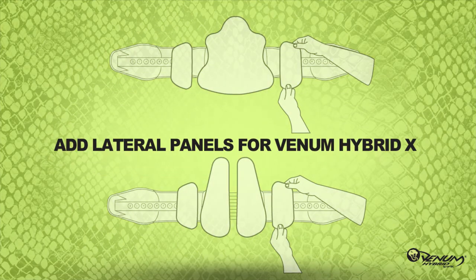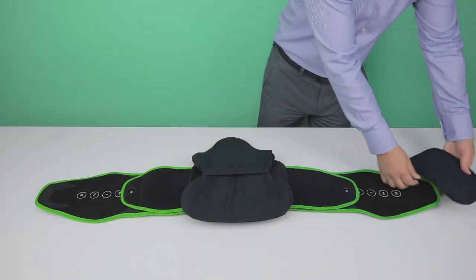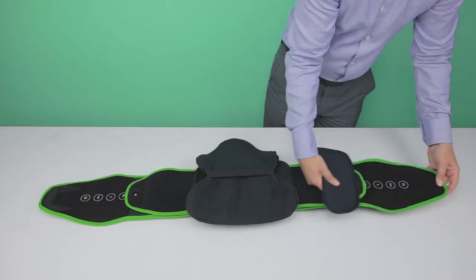The Venom Hybrid X-Model features two lateral panels. To assemble the lateral panels, slide them over the belt to the desired position and press down firmly.